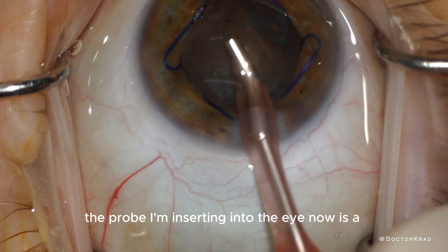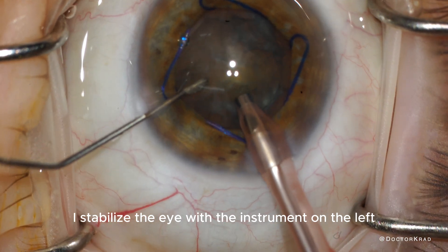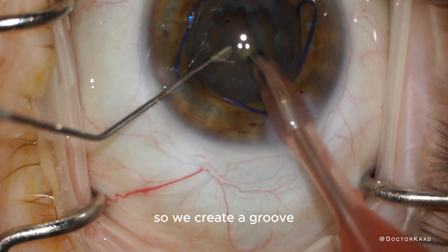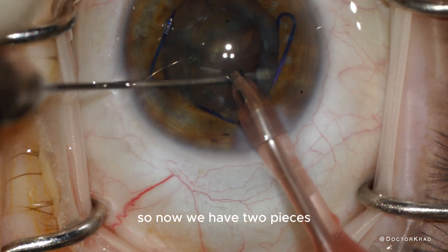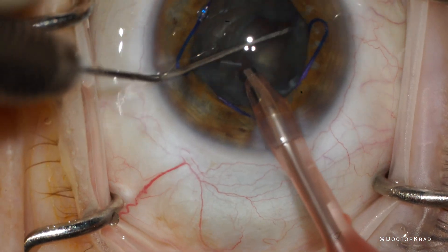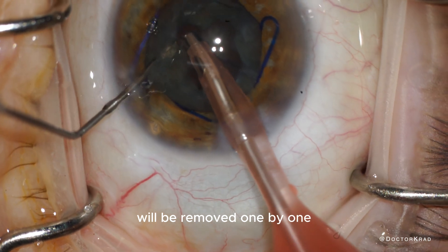The probe I'm inserting into the eye now is a phacoemulsification probe — it uses ultrasound energy to break up the cataract. I stabilize the eye with the instrument on the left. We create a groove or trench in the middle of the cataract and then crack it in half — so now we have two pieces. Then we rotate it 90 degrees and separate one hemisphere into another half, giving us three pieces. Finally, we crack the last half, and now we have four quadrants.